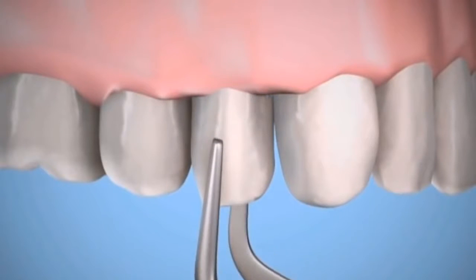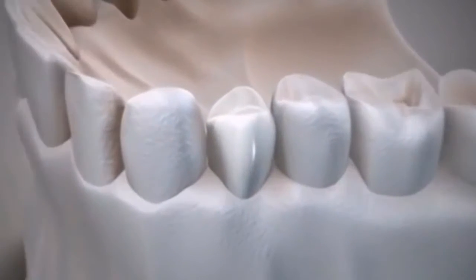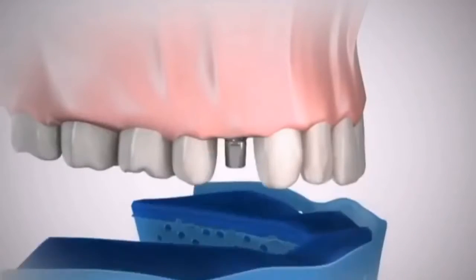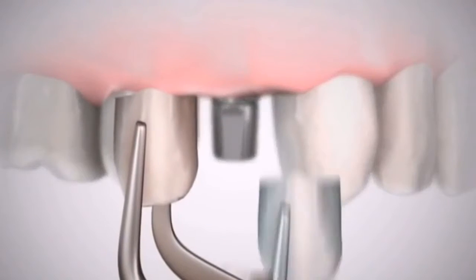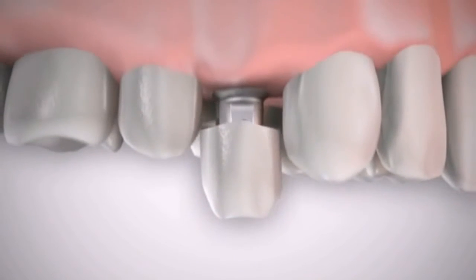The permanent crown is completed by a truly simple process. Size and distance are measured and the color of the natural teeth is examined in order to create a perfect match with the new crown. The crown is secured into the implant using a screw or special cement, using no anesthesia and causing no pain.